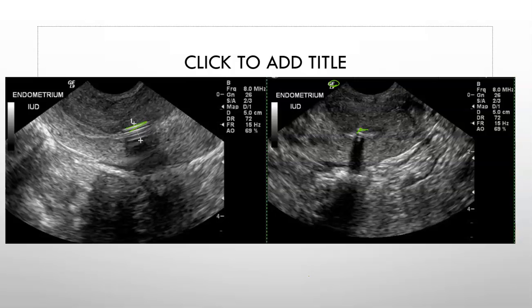And so she turned this in as being a misplaced IUD, and we found a reference to the GE technical worksheet that said that this could happen, and included it with the examination so that the physician could then make the diagnosis whether it was in or out.